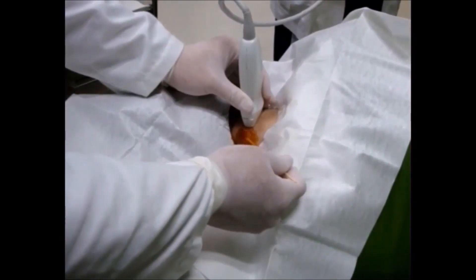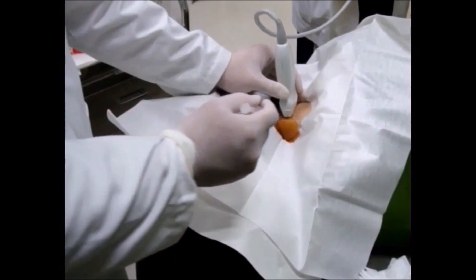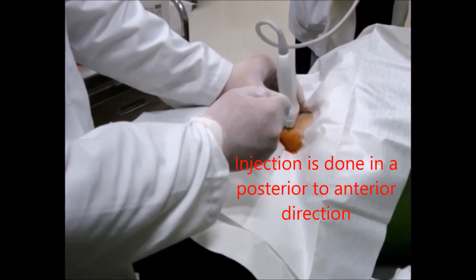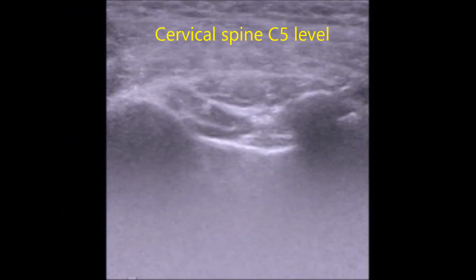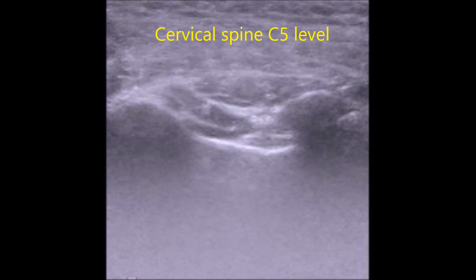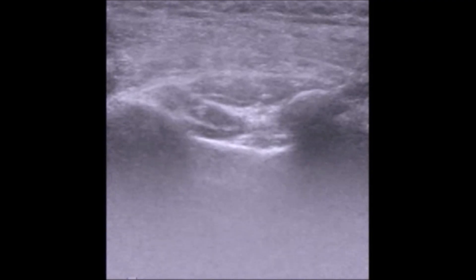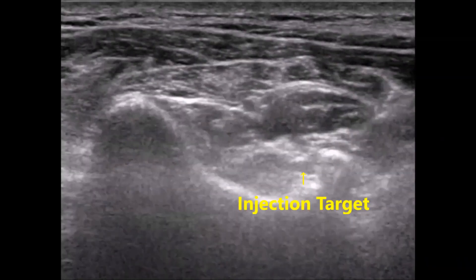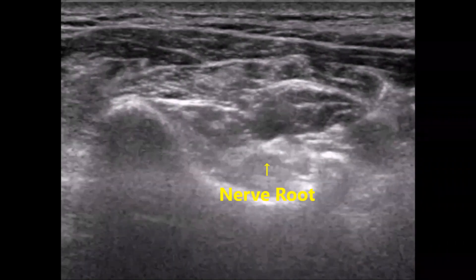Before the injection, the skin is prepared with povidone-iodine and strict sterile precautions are carried out throughout the injection procedure. The injection needle is in-plane with the transducer. There must be a safe distance between the needle and the transducer to avoid contact with the gel and the transducer, to prevent infection. The C5 level is characterized by similar heights of the anterior and posterior tubercles. The nerve root rises from the trough of the transverse process, and the injection target area is the intertubercular groove between the nerve root and the posterior tubercle.